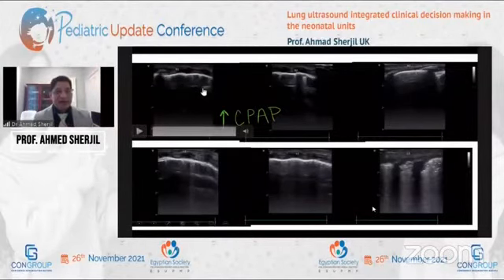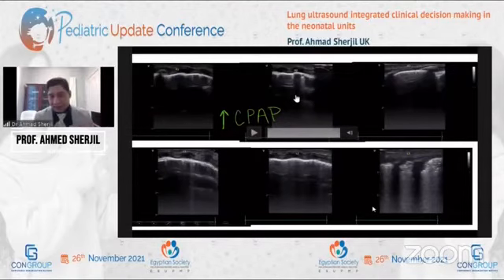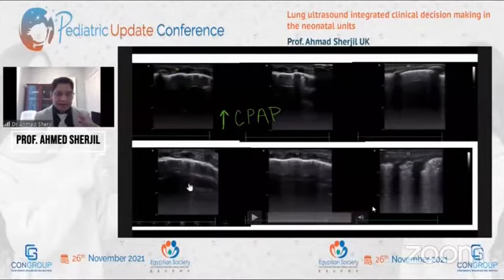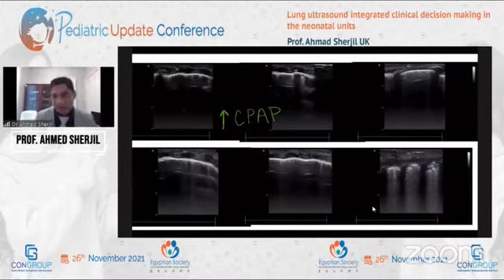You're seeing some horizontal lines straight away. R2 again, yes, it's full of some other pathology, and still, I wasn't expecting things to just disappear, but the alveolar recruitment, inflation of lung is remarkable here. Similar happened on the left side. And I do understand on L3, which is moving now, you're still seeing a lot of pathology there, which was nothing unexpected, no surprises.